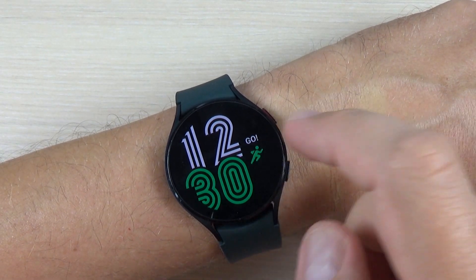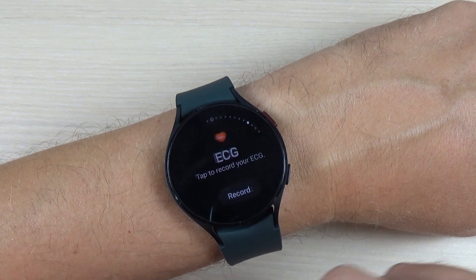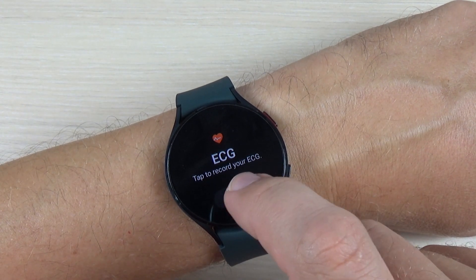Now let's go back to my watch, swipe right again, and just press record.